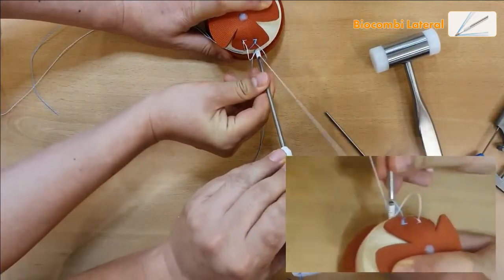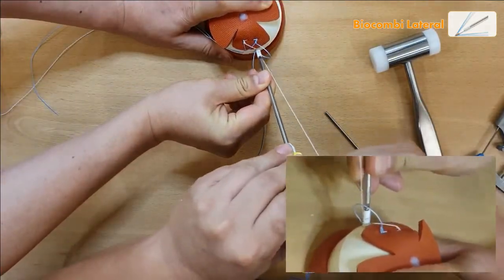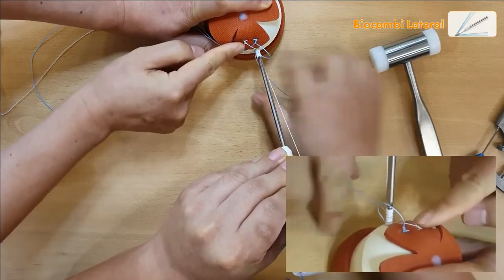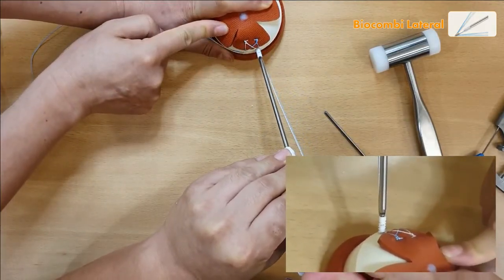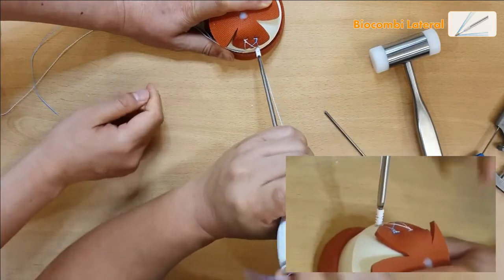Now, I'll pull it. You can have the desired tension that you want. Now, screw it.